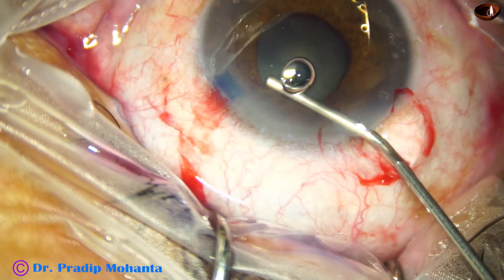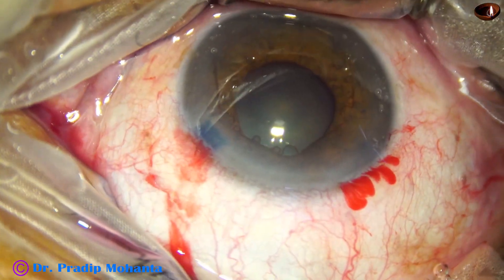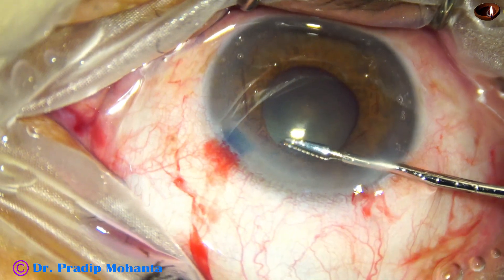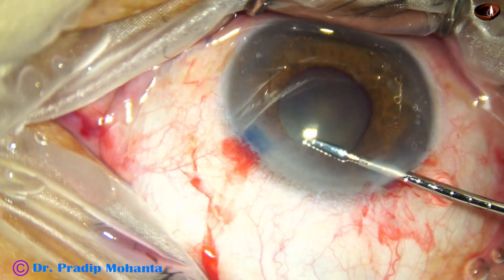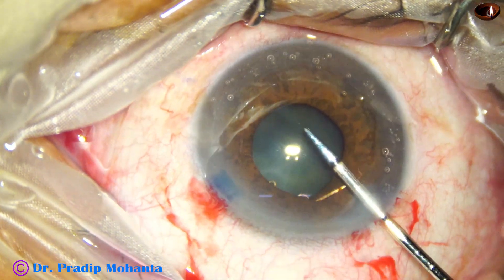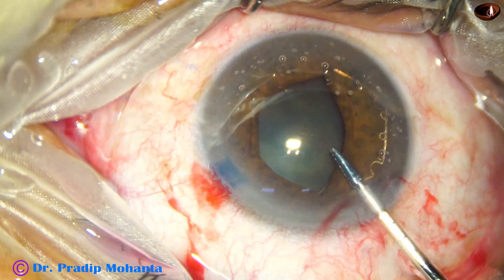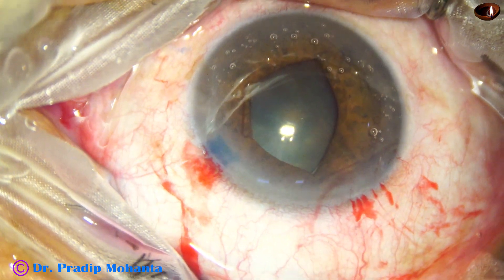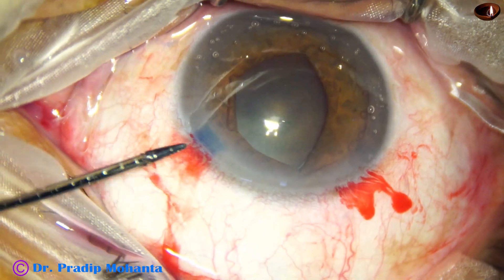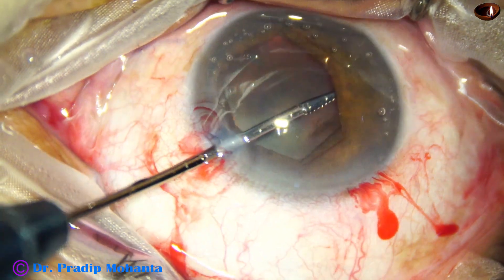I find that if I tuck the flange which is at 11 o'clock — which is near the left side port — if you are a right-handed person and tuck this flange first, it becomes easier. And if we tuck the flange which is at 5 o'clock, which is directly opposite the main wound, we can do it, but it is easier if we tuck the flange on the left side first, and then the flange directly opposite the main wound, then add visco and use the B-Hex forceps to finally tuck the flange on the right side of the main wound.